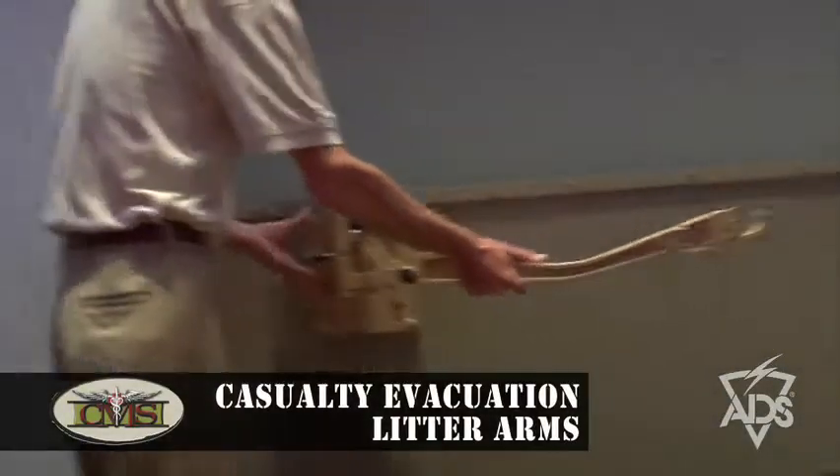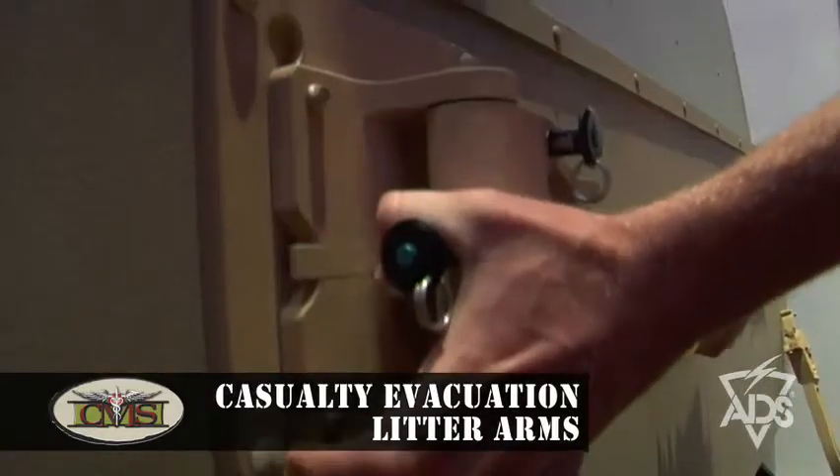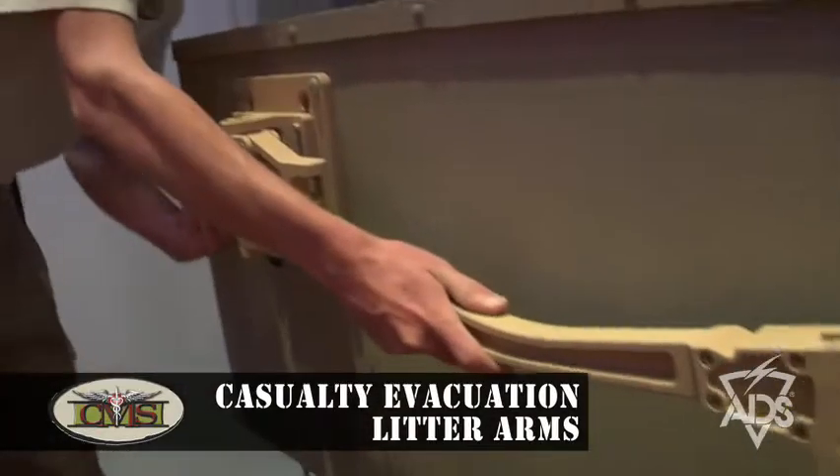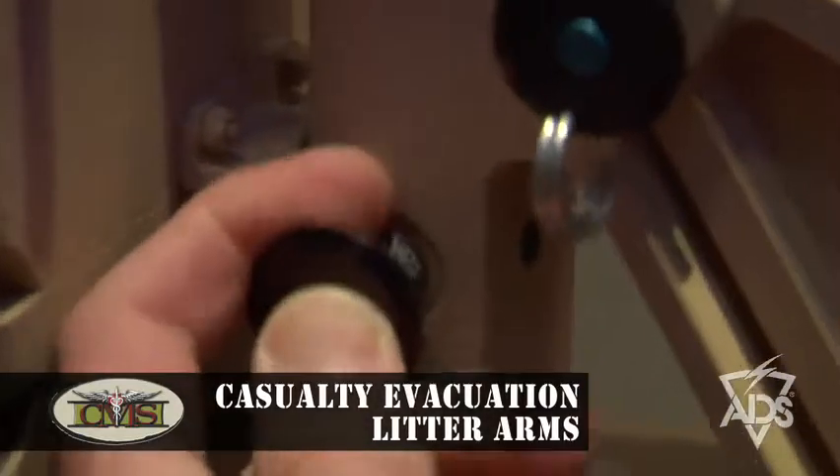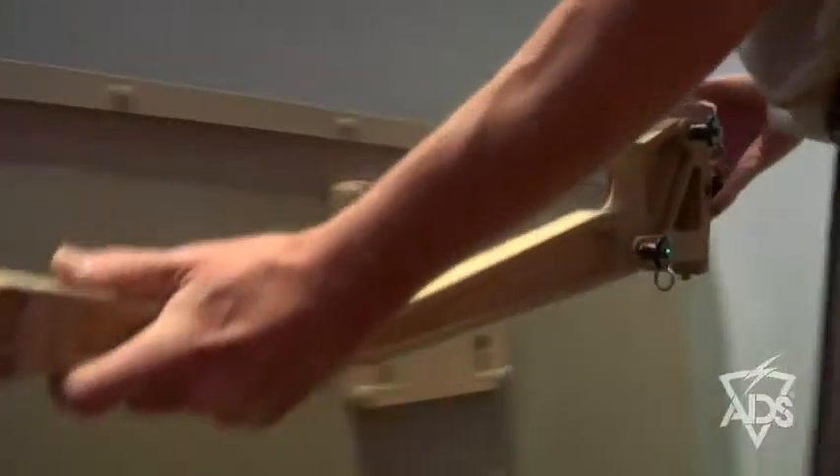This is the litter arms, which is another part of our casualty evacuation line. The key feature is a universal mounting plate which can be placed on a Humvee, MRAP, or some kind of land vehicle. However, it can also be placed in airframes, on a watercraft, or on a stationary object if desired.